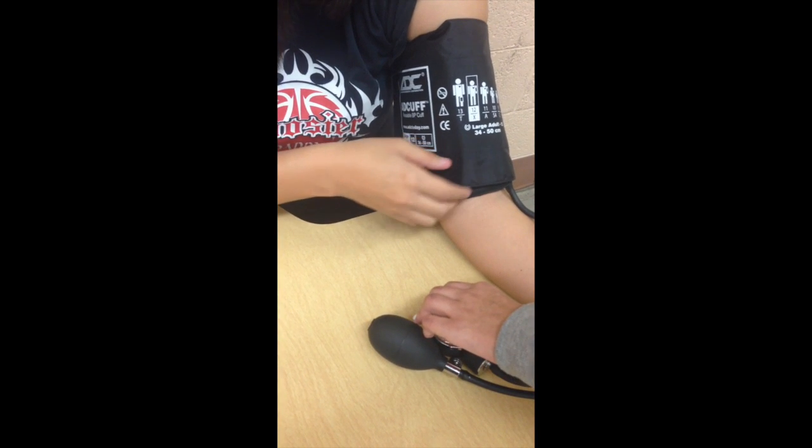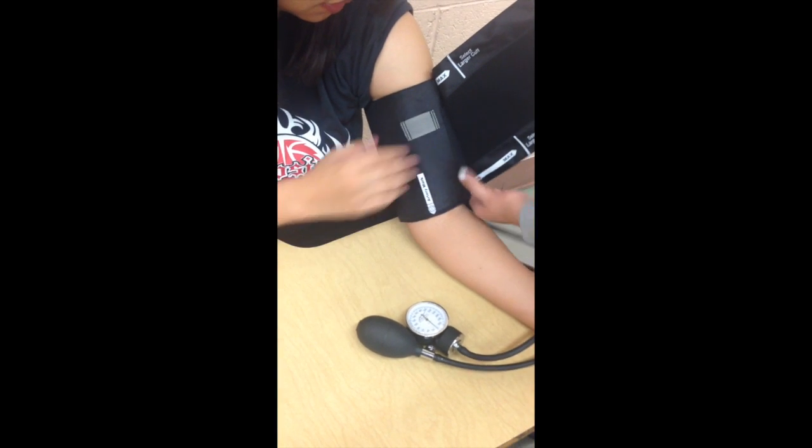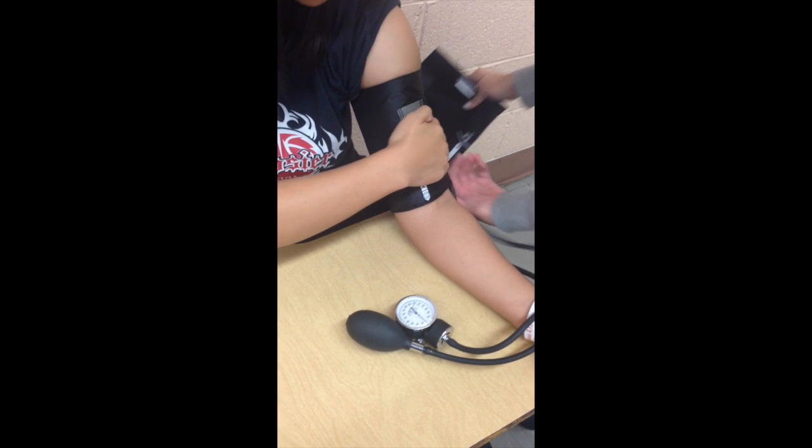It is also very important to make sure that the cuff is wrapped tight enough around the patient's arm. If it is not, you can easily adjust it to where it is comfortable.